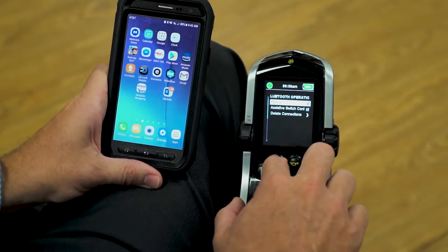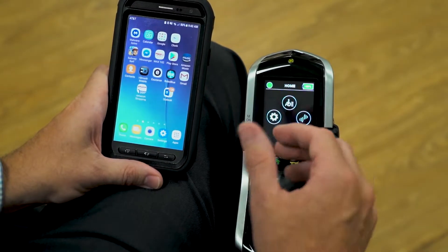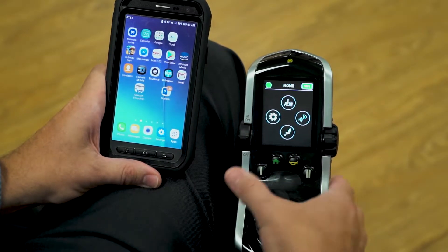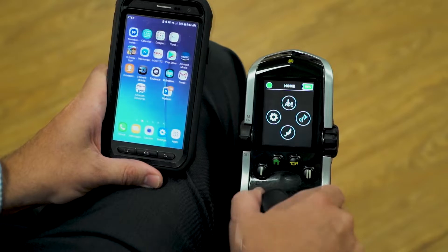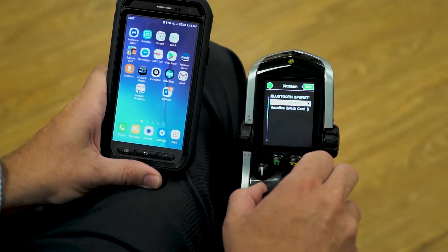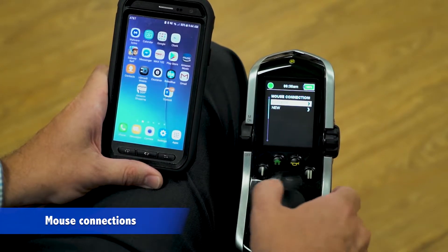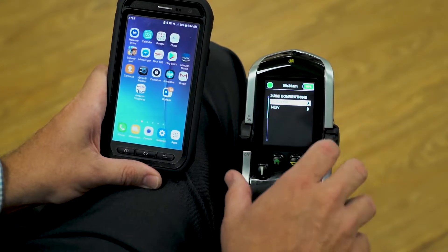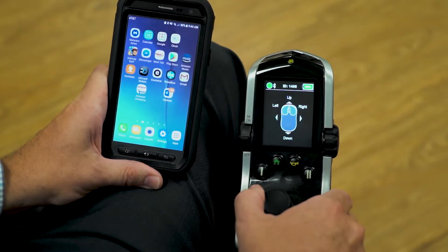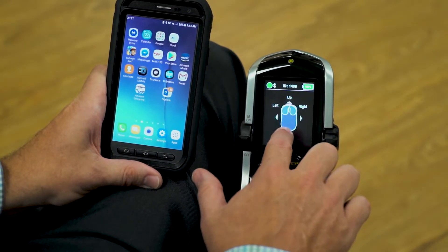Another thing is that you have a number of devices you can actually pair to the Bluetooth at the same time, so keep that in mind that there's a lot of options available. I'm going to go over to the icon that signifies our connections, and I want to go to mouse connections. I'm going to go down to new to add the Android phone, and we are now in a discoverable mode.